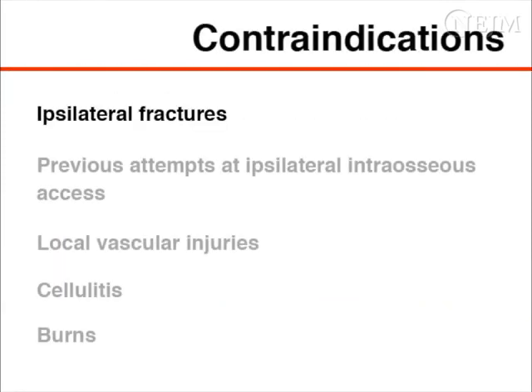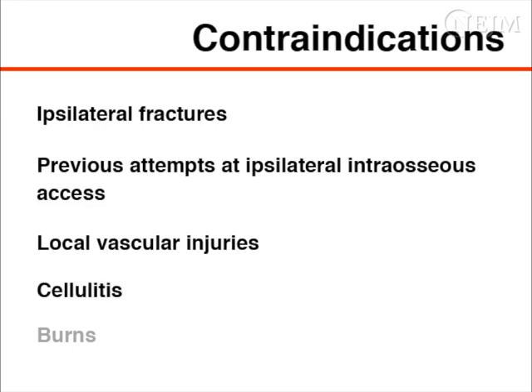Contraindications include ipsilateral fractures, previous attempts at ipsilateral intraosseous access, local vascular injuries, cellulitis, and burns.